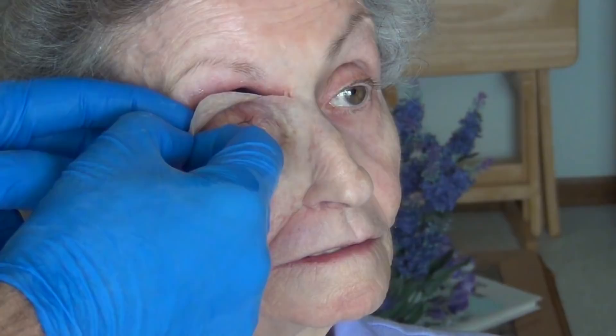Sometimes we create larger orbital facial prostheses. In this case we utilize the stability of the patient's intraoral appliance called an obturator. The obturator, modified with a corrosion-proof magnet, anchors the orbital prosthesis in an easy, predictable fashion without any adhesive.